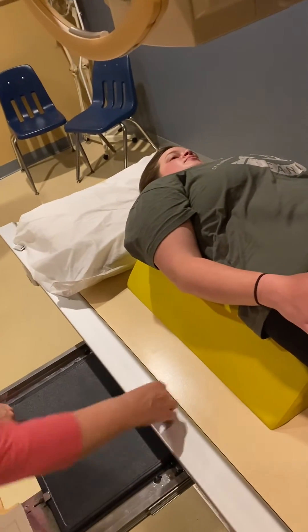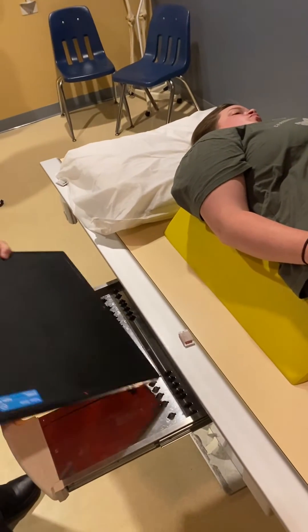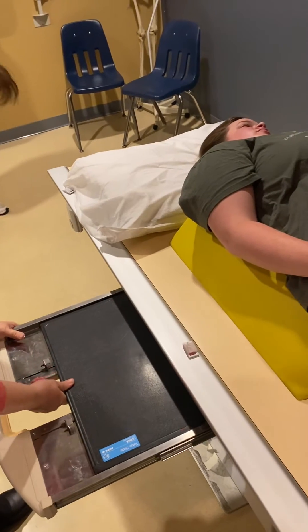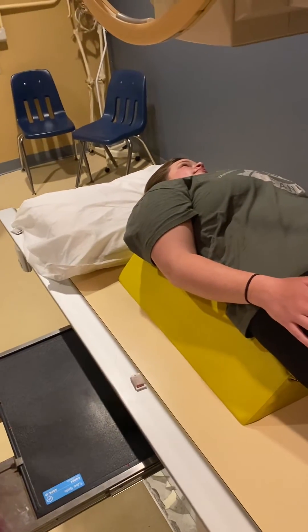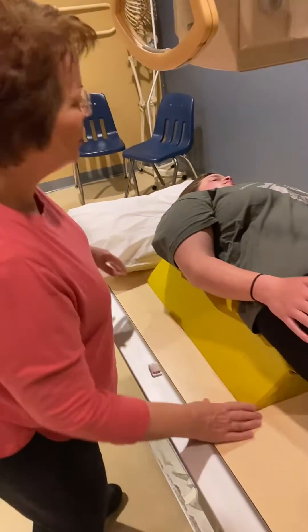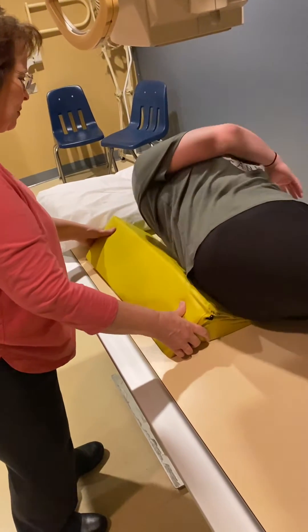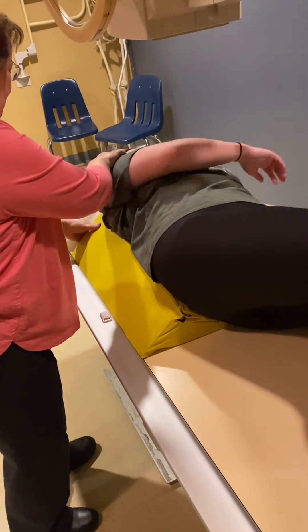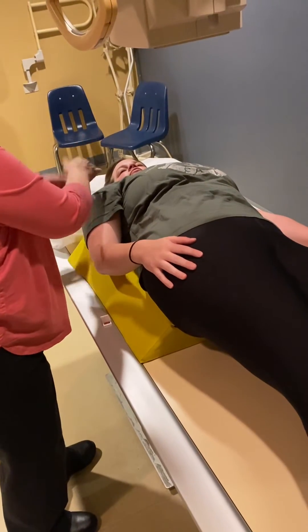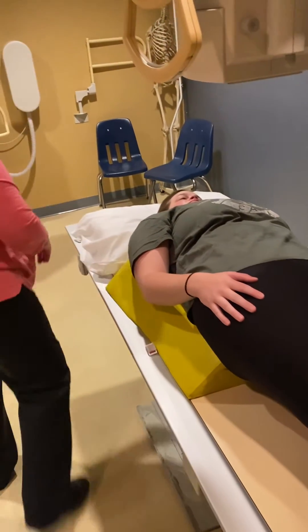This is going to go lengthwise here and our patient is obliqued 35 to 45 degrees — this is a 10-degree range. 35 to 45, and the patient should have been scooted back. Just bring your body back a little bit more — scooch it back. There we go. Very good. 35 to 45.